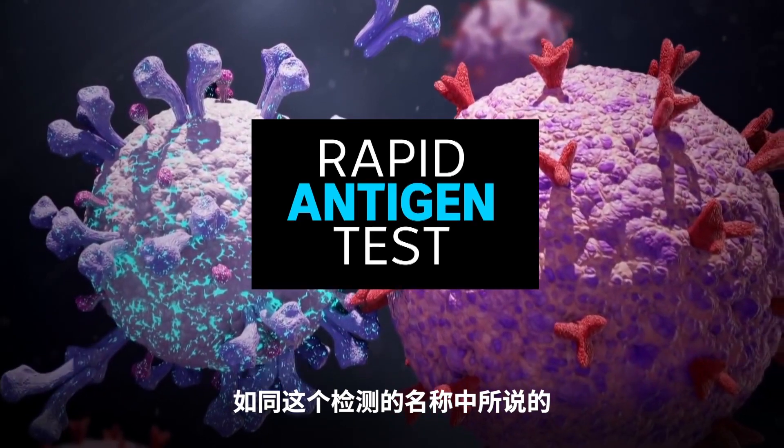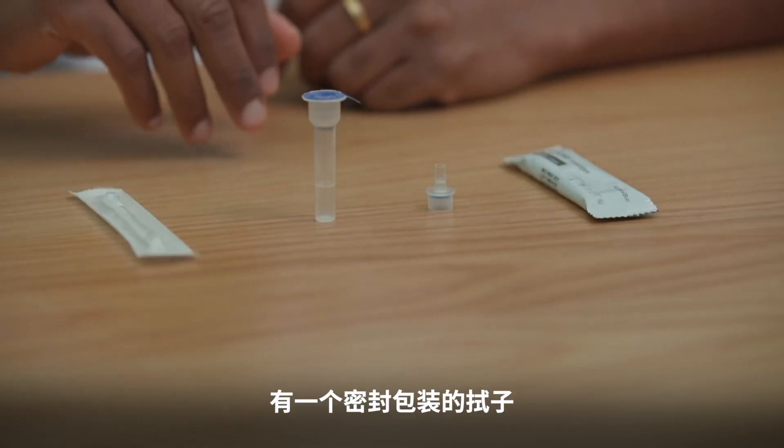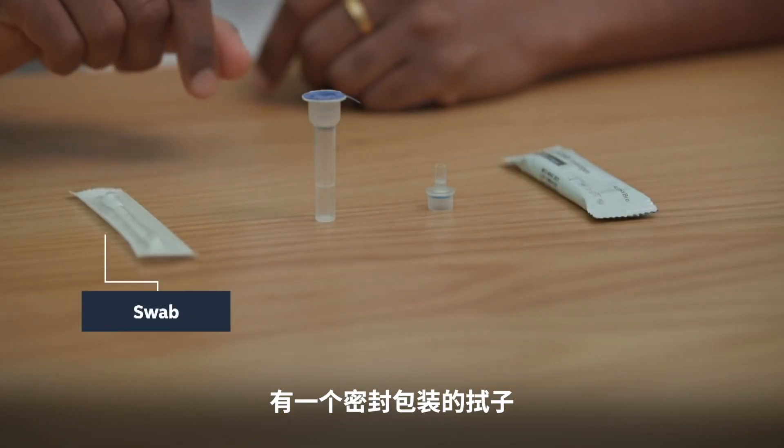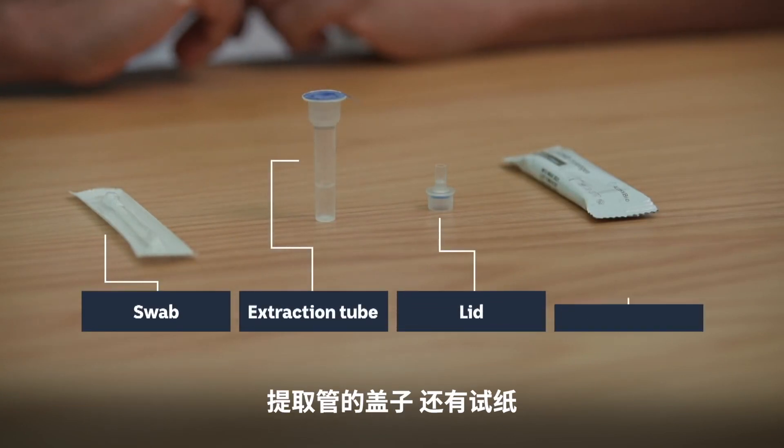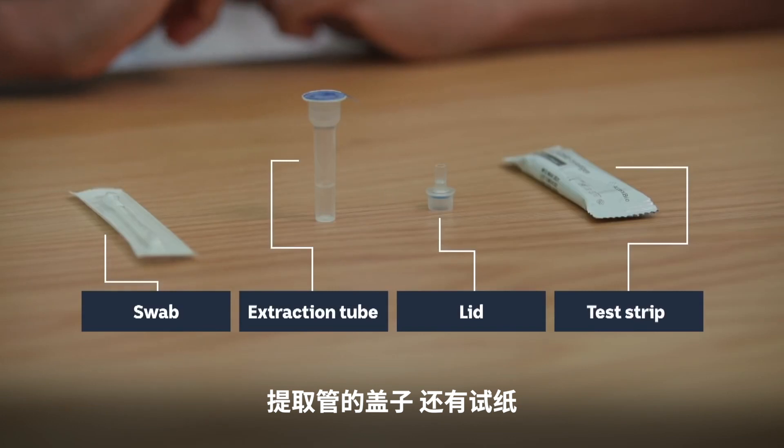The clue is in the name. There's a range of test kits and they all come with the same basic parts: a swab inside a sealed wrapper, an extraction tube that holds the testing liquid, a lid for the tube, and the test strip.